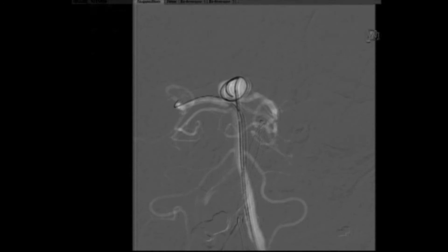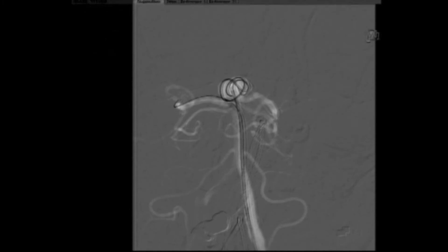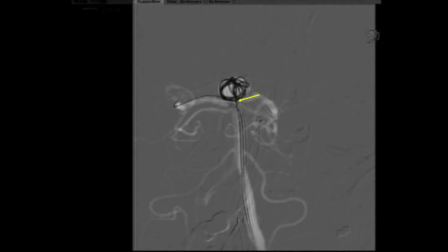Despite moving the balloon into a more proximal location, trying to cover the left side of the neck of the aneurysm, there was persistent herniation of the coiled mass, compromising the ostium of the left posterior cerebral artery.